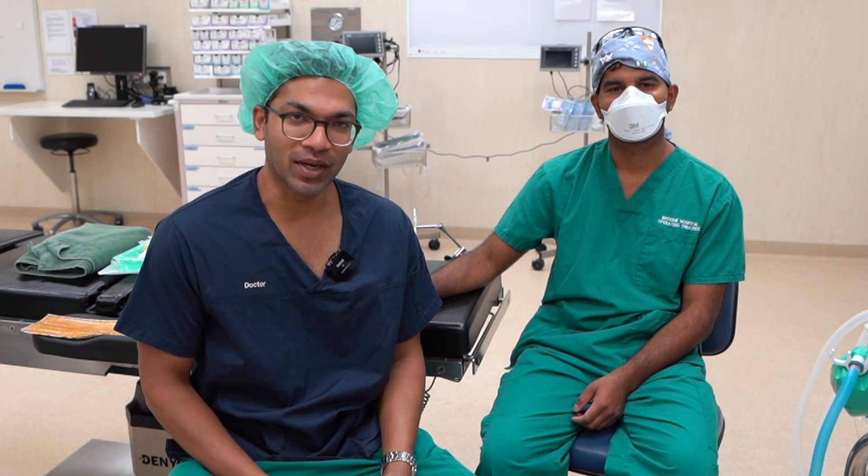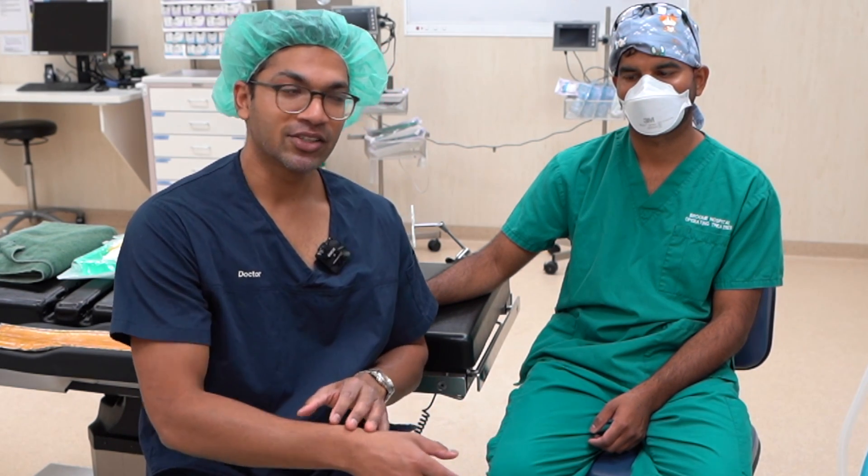Cannulation in a dark skinned person is a little bit different — you don't get a lot of the visual cues that you might get on a lighter skinned person. For example, every time you see a vein on a light skinned person you get the sense of a bluish tinge there. That's probably the main difference with dark skinned people.